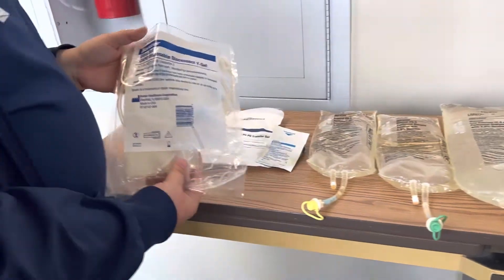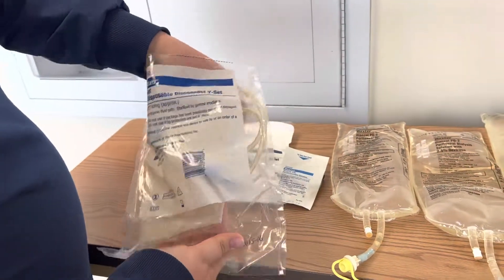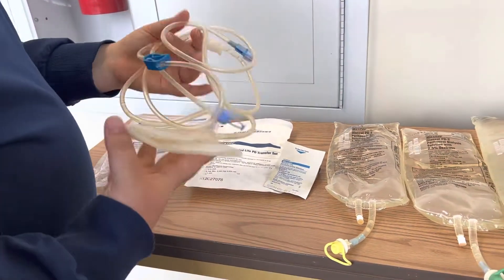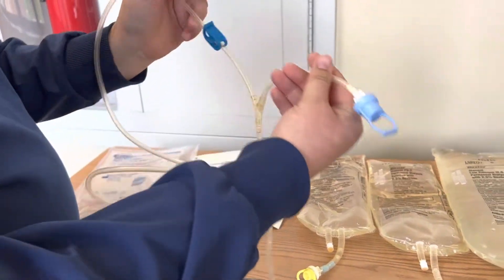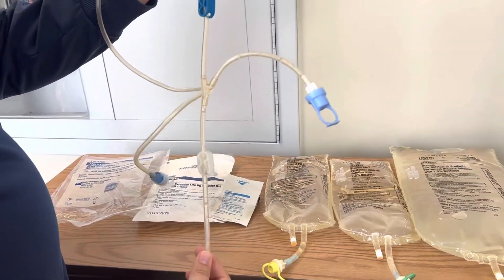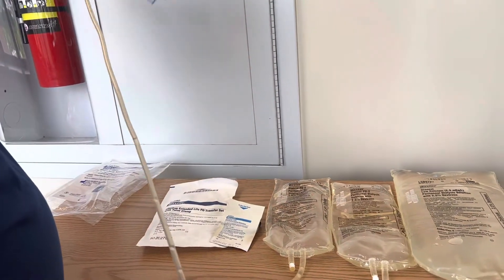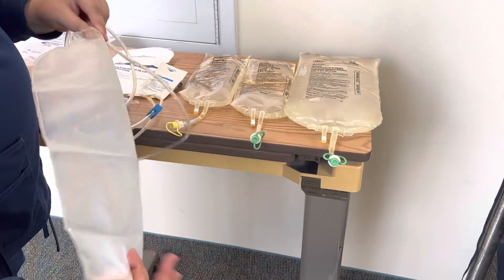To get everything ready, you want to first start with this ultra set disconnect Y set. When you open that up there should be a little Y port here. Both of these clamps should be closed and you want to make sure that you've got a bag attached to the end of your tubing here.